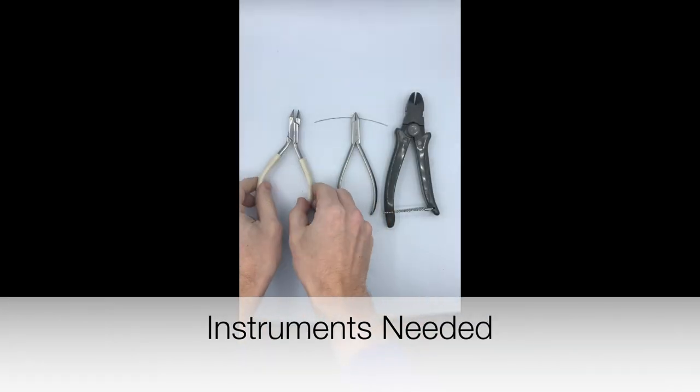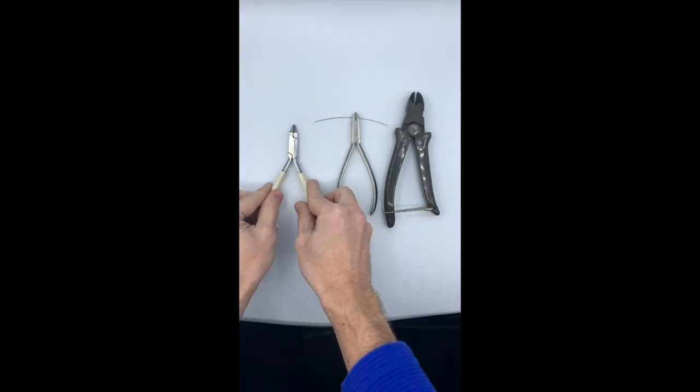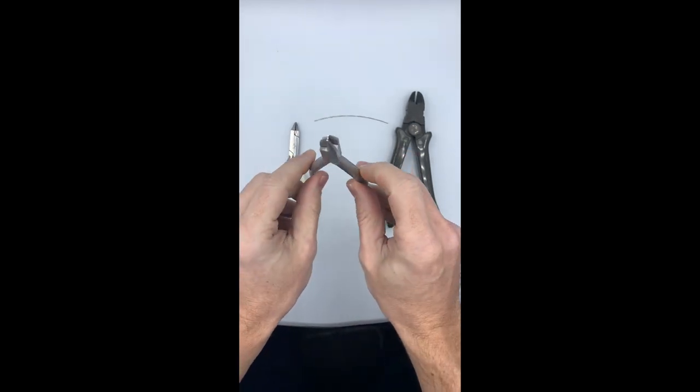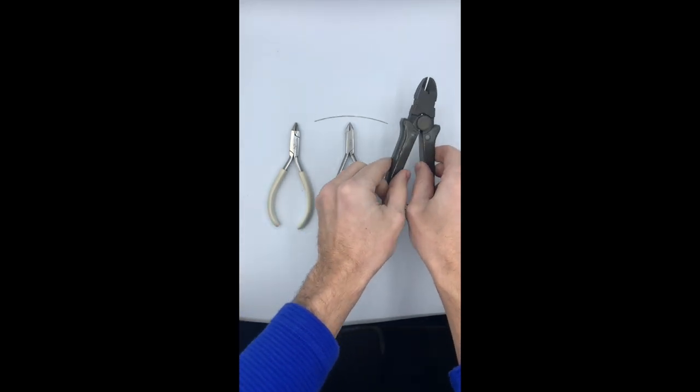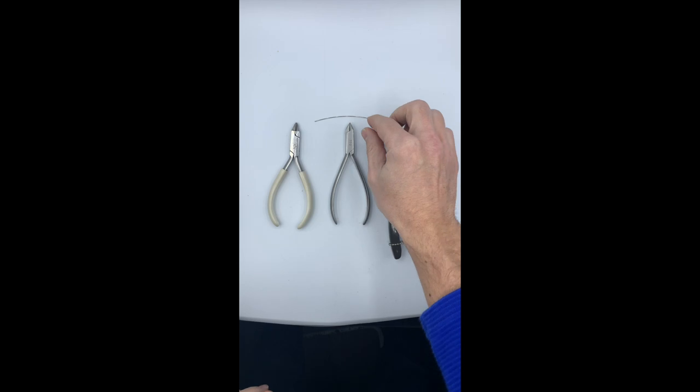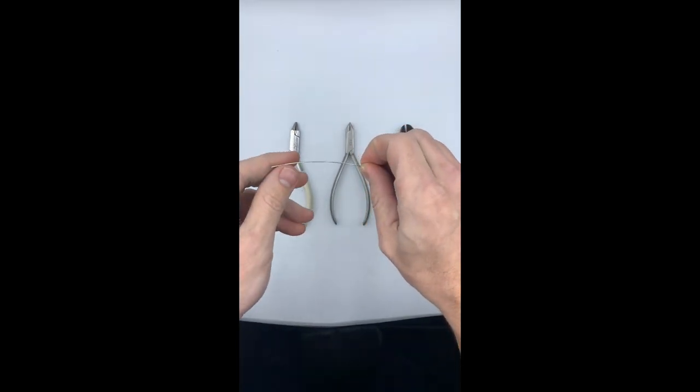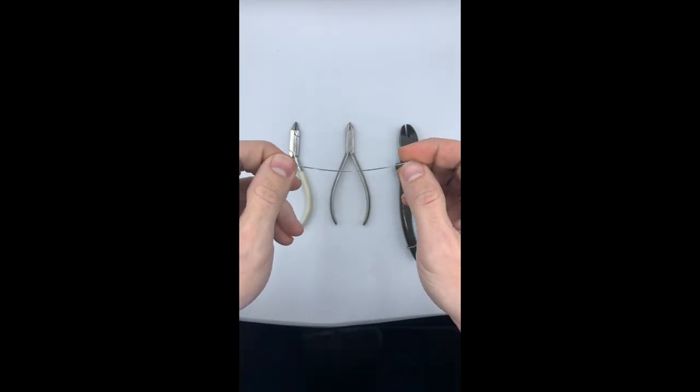The instruments needed: a 139 plier, a 3 prong plier, a wire cutter, and a 3 inch length of 036 wire.